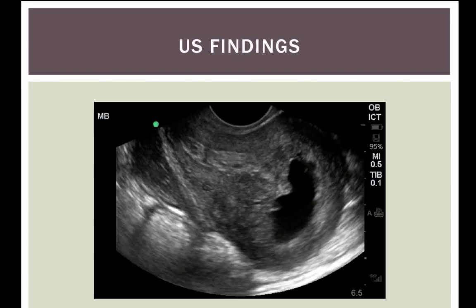What do we see on ultrasound? We've got a retroverted uterus - the fundus points posteriorly - and we've got a sac within the uterus. It looks in about the right place. Here's the endometrial sac, it's up at the fundus, but it has a weird shape and I don't really see anything in it. Complete sweeps through there didn't show anything within that sac.